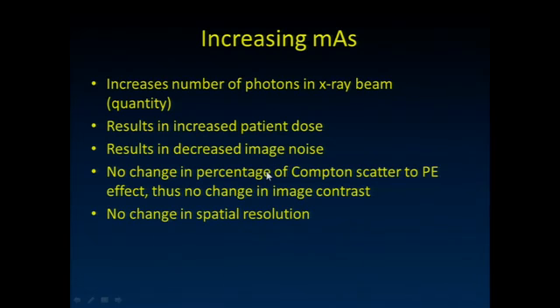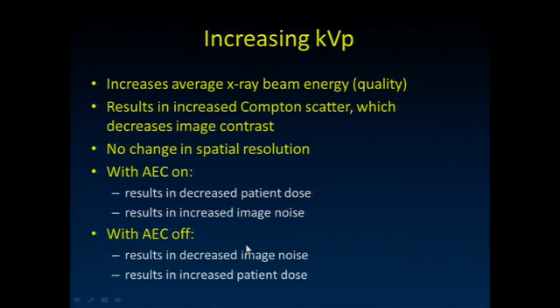It has no change in the percentage of Compton scatter to photoelectric effect, and therefore no change in the image contrast, it just decreases the image noise. And there's no change in spatial resolution.